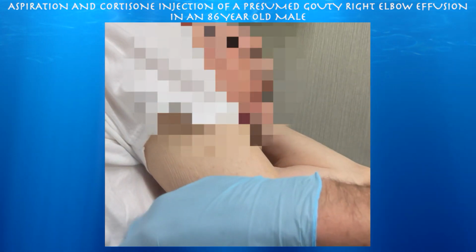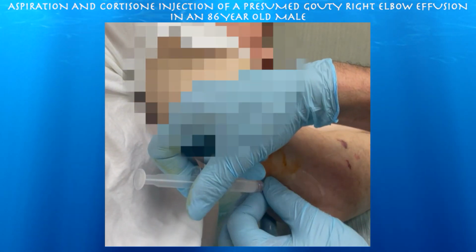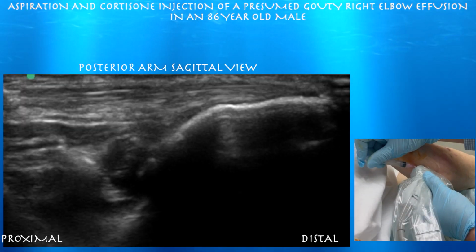Looks like you have gout, I think, okay? I think this is a gouty attack. Cortisone. Ultrasound. Here I'm injecting a mixture of saline with 10 milligrams of Depo-Medrol into the olecranon fossa.